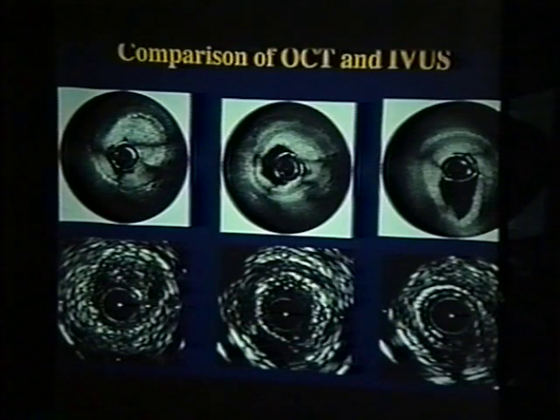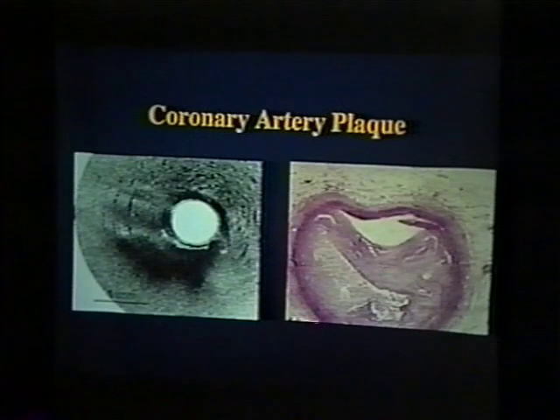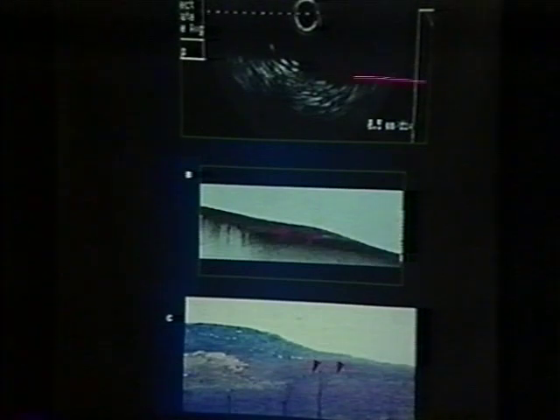Again, this slide, also older, shows the ability of OCT to identify these high-risk plaques, which can't be identified with any other technology. What we're looking at is a collection of lipid within the wall of the blood vessel and a thin intimal wall. What happens is when the heart contracts, pressure comes in from the top, the plaque ruptures from the site and releases this fat, which causes a clot. In the second image, we're looking at an area that looked relatively normal from the surface, but fissuring is occurring to the intimal medial border, which is another indication of instability at that site.